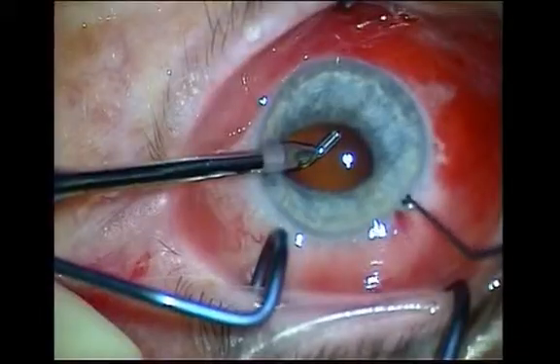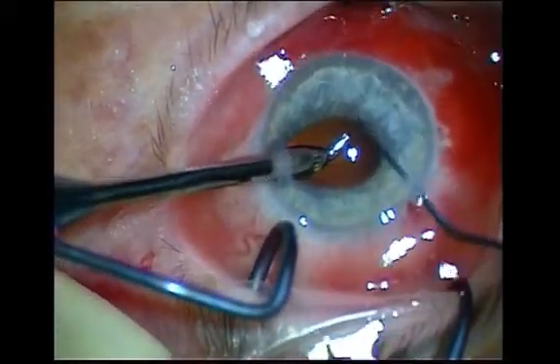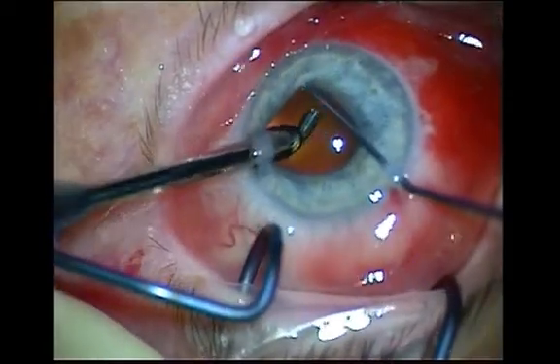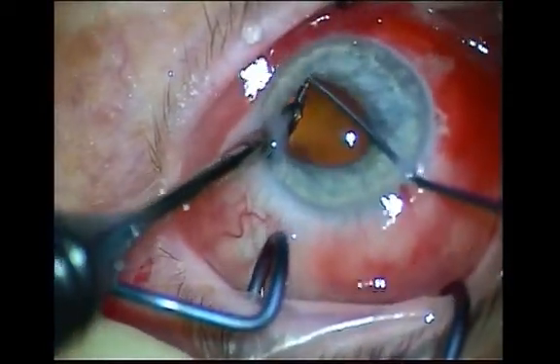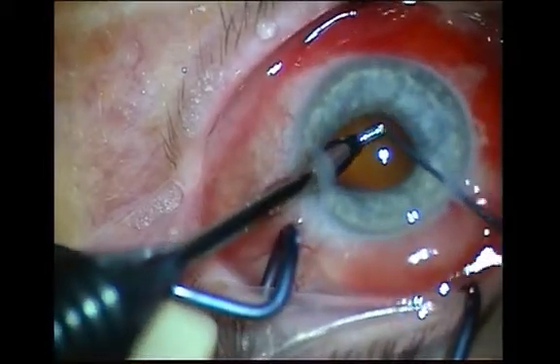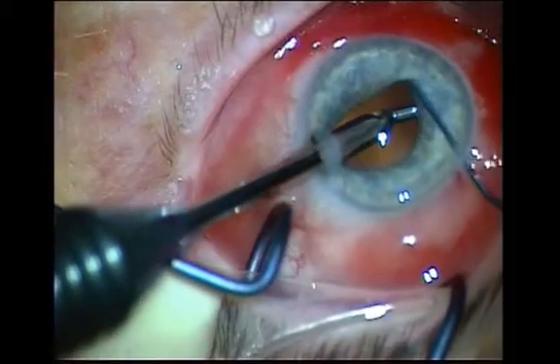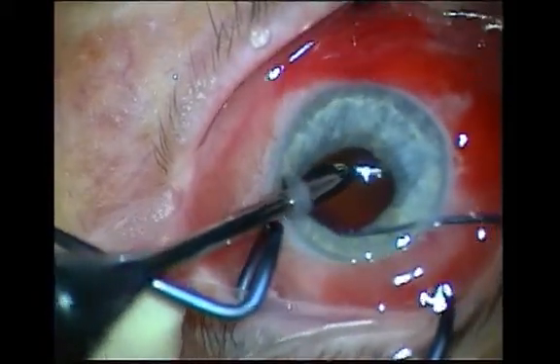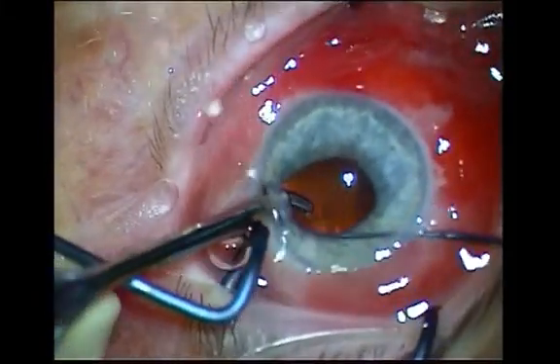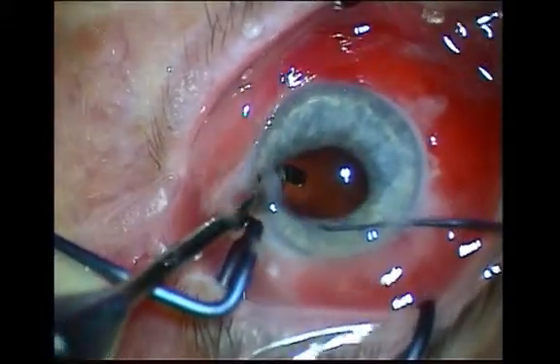If the pupil starts to reduce in size, a two-handed technique can be used, where another instrument is used to push the overlying iris out of the way to allow proper visualization of cortex, as shown in this video. In this instance, a Kuglen hook is used to push the overlying iris out of the way, enabling visualization of the underlying cortex.